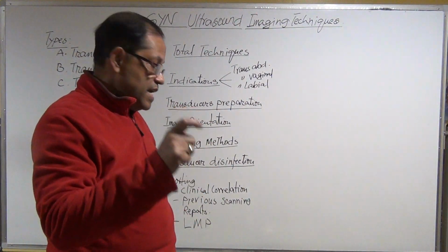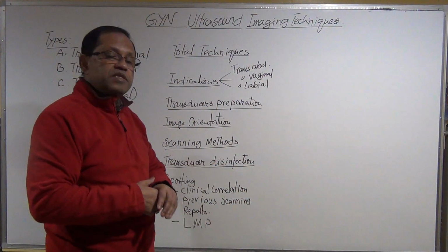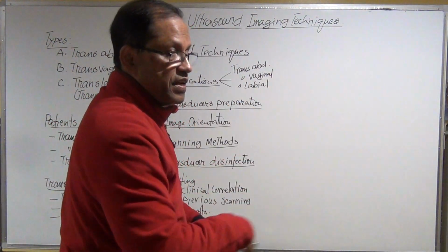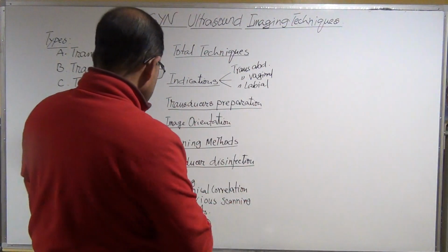It has a separate guideline for disinfection, and a separate room for making the transducer disinfected and sterile. Okay, so it is very important.